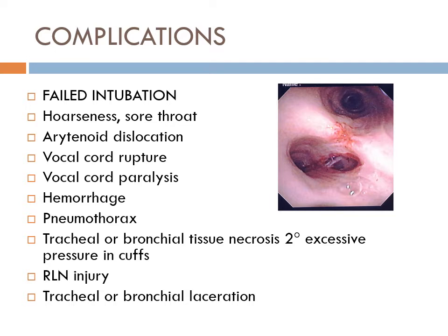So I'm traveling down through the vocal cords. The first thing I'm going to notice as I'm going down is that if I'm walking along, let's say, the posterior part, I'm walking on like these longitudinal muscle fibers, okay? And then above me, my roof is these cartilaginous rings. You could probably think of this in a lot of different ways. That's how I'm thinking of it. And so as I'm walking, I look above me and I should see rings, like structural rings, like you're in some type of dome. If I see that, then I know that right is going to be right main bronchus, and left's going to be left main bronchus. Does that make sense?